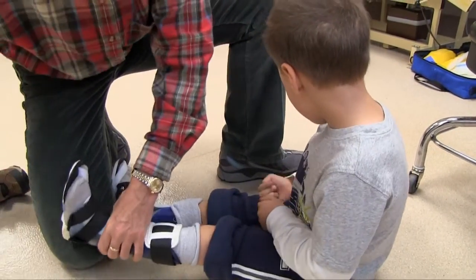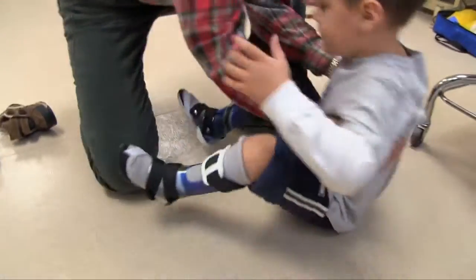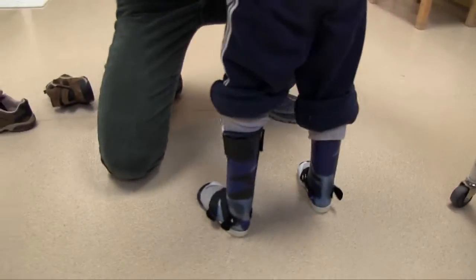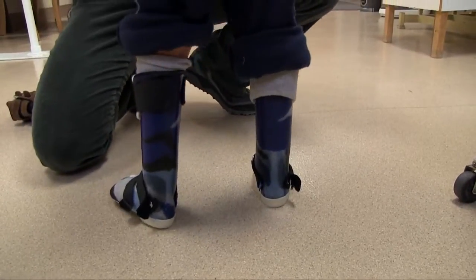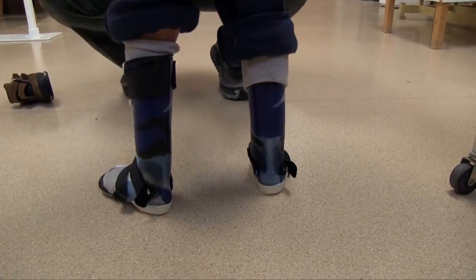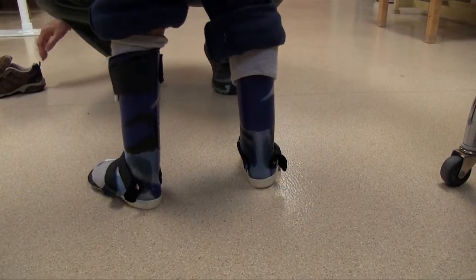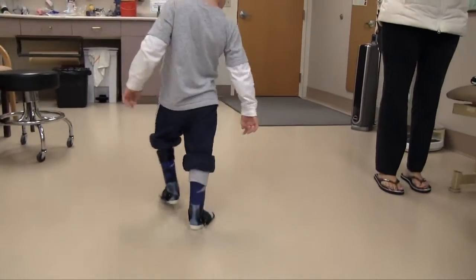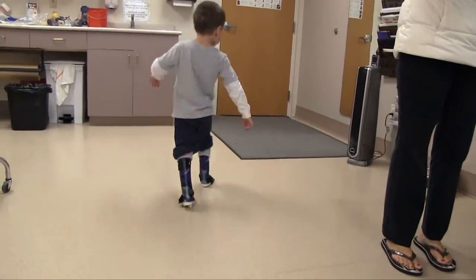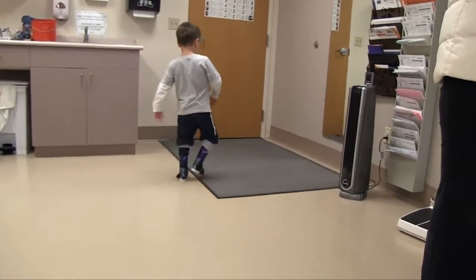We've decided to go ahead and remove the shoes and see what the angle looks like without shoes. I really want to check and make sure that it is the dorsiflexion angle and not the heel last of the shoe — I believe it's a combination of both. Here we had him walk without the shoes and his walking was significantly improved, but again that's with the dorsiflexion angle at 3 degrees.